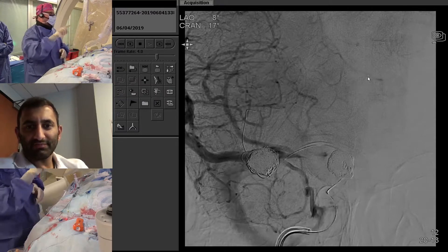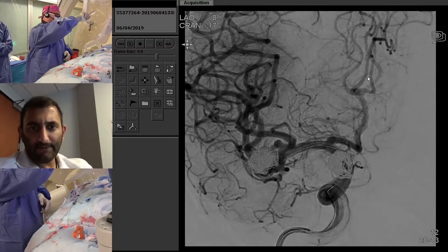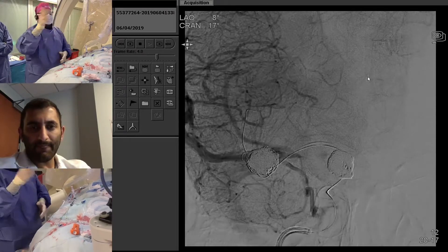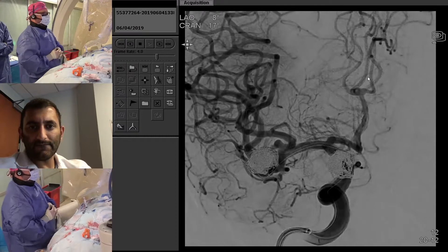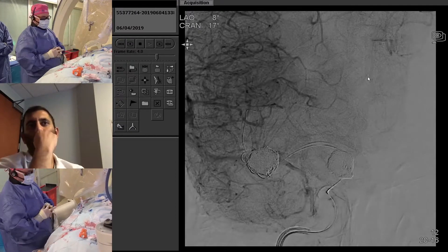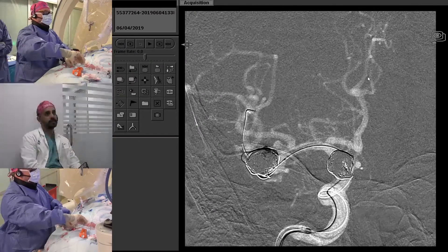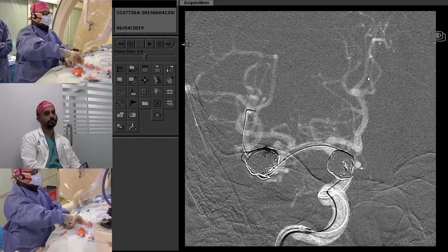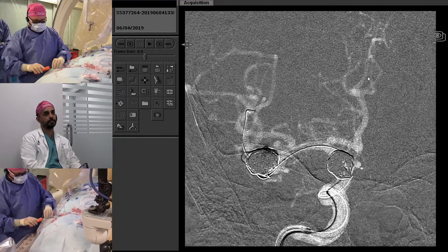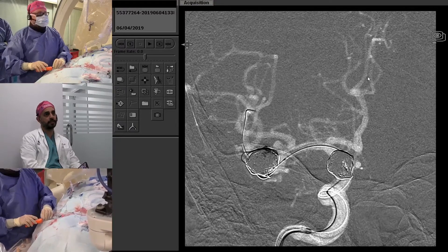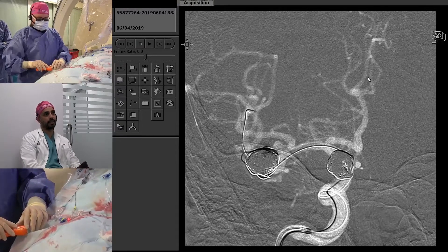When she comes back in a few weeks, we're going to stent and treat the other MCA aneurysm. The stent will end up covering this neck a good bit, so even if there is a little something remaining, that'll take care of the rest. For the last bit, I'm going to inflate the balloon and use it to stabilize the microcatheter while pulling it out, so we don't accidentally pull any last coil loop out into the artery.